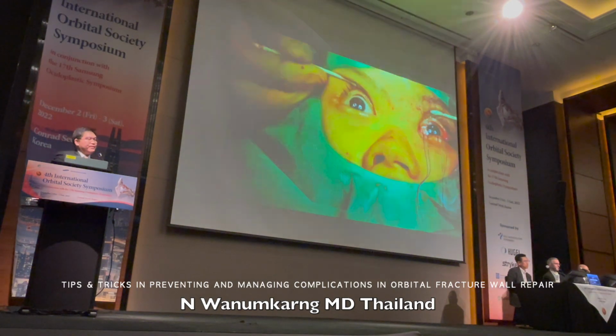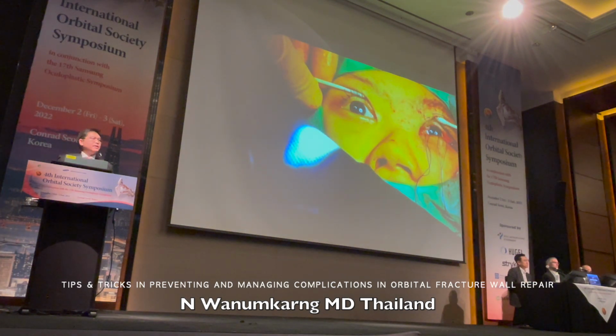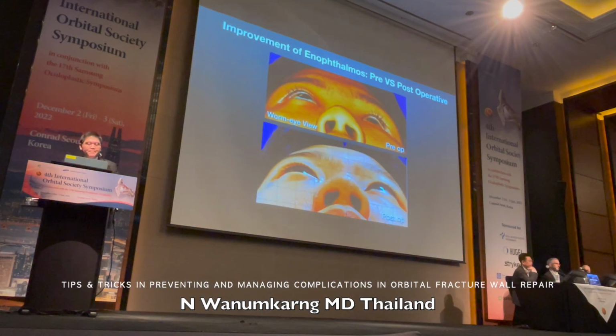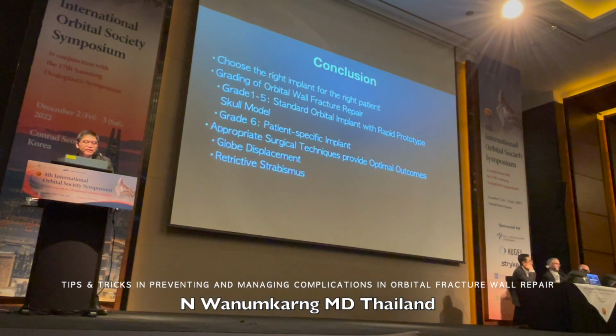This is the benefit of the PMMA implant. In this case, on the fifth attempt at the force duction test, I got 100% freely from the force duction test. That was at the end of the surgery. So we can get a very good result, with globe position coming back to nearly 100%.